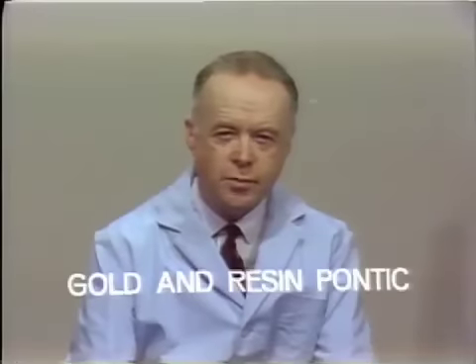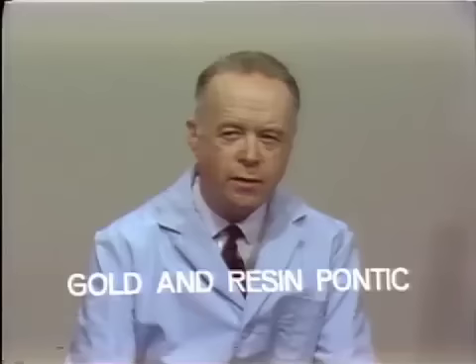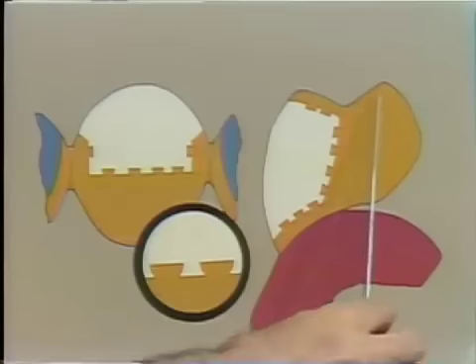The modern tooth resins have good color stability and good resistance to abrasion, and they make very useful and satisfactory facings for bridge Pontics. The typical relationship of the gold and resin of a bridge Pontic is seen in this diagram here. This represents a bicuspid Pontic with a ridge lap relationship to the mucosa. This would be the buccal surface with the resin facing here. This is the lingual surface with the gold backing and occlusion here.